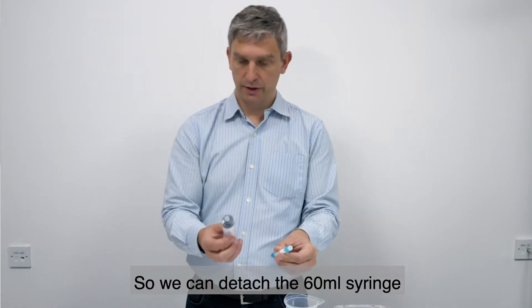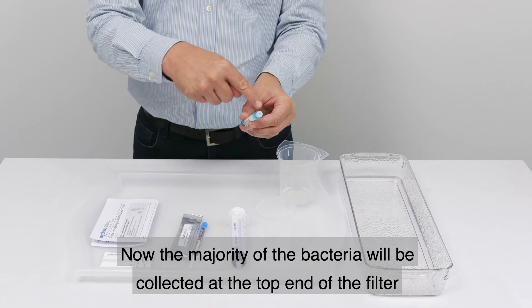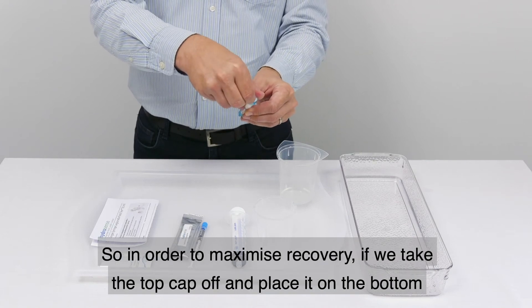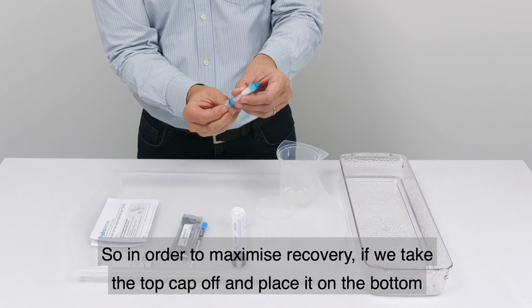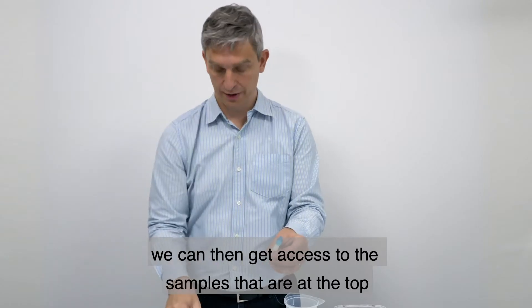We can detach the 60 ml syringe. The majority of the bacteria will be collected at the top end of the filter, so in order to maximize recovery, we take the top cap off, place it on the bottom, and can then get access to the samples that are at the top.